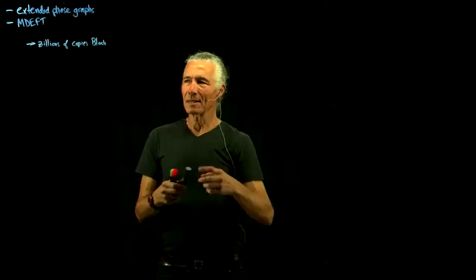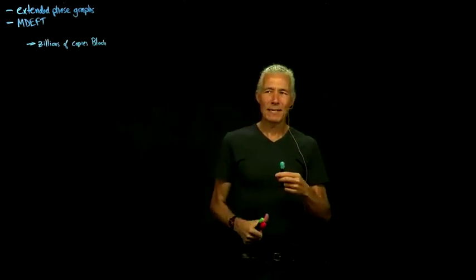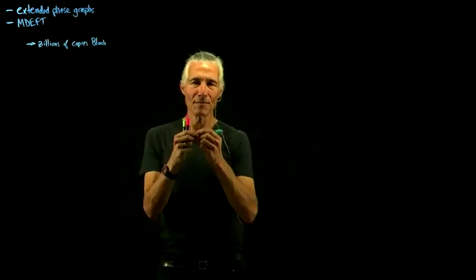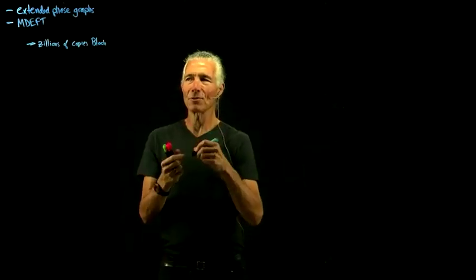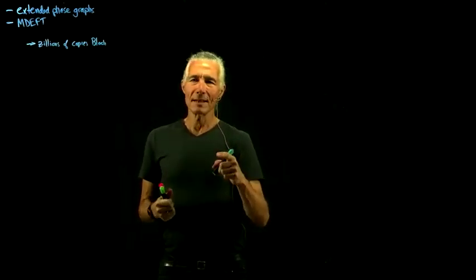And so to simulate what's going on as spins get out of phase with each other, each different out of phase spin due to a problem with the B0 is going to need another Bloch equation.